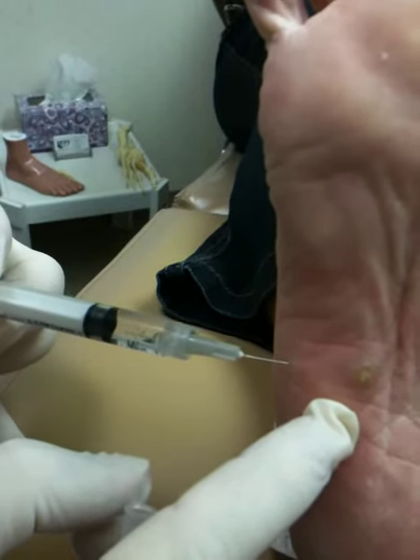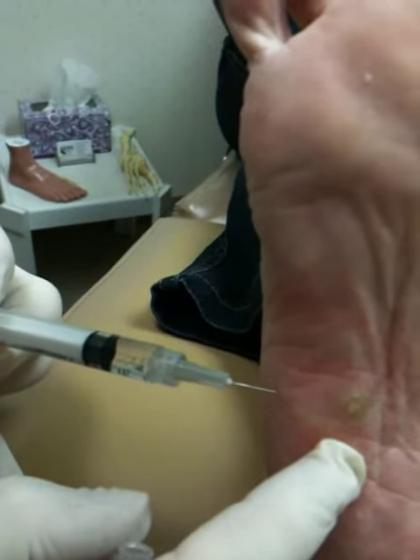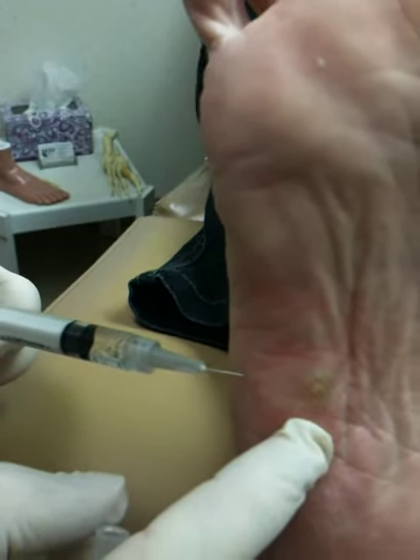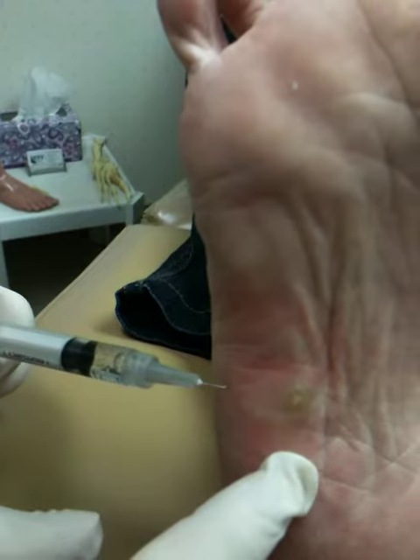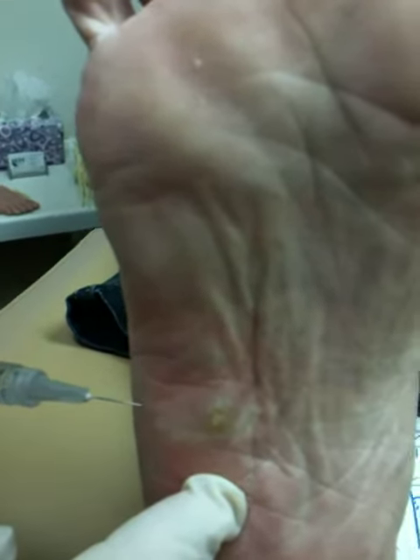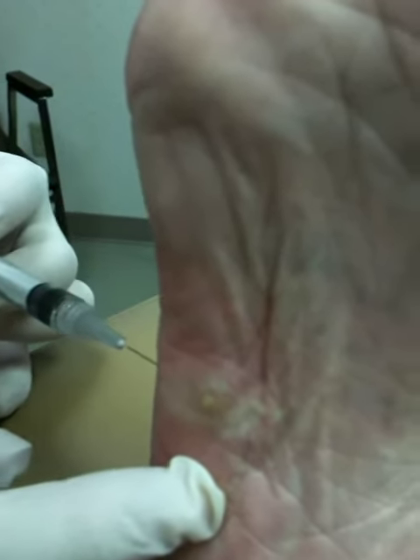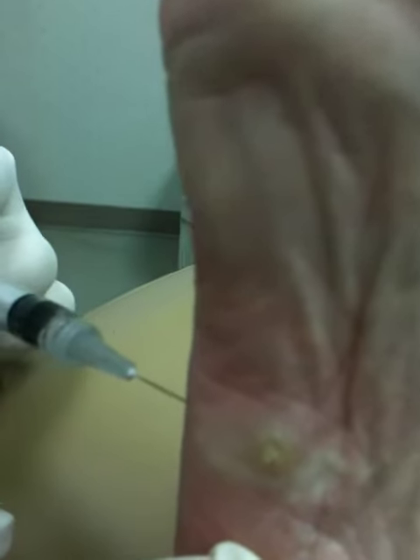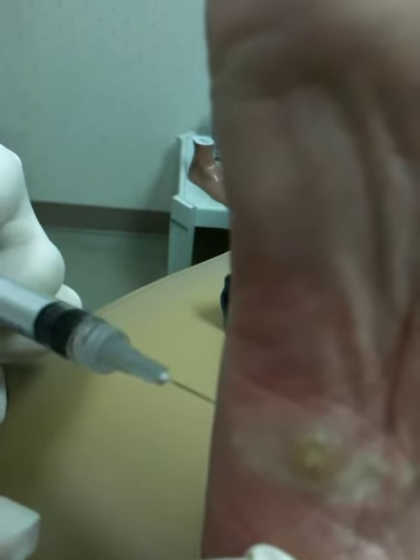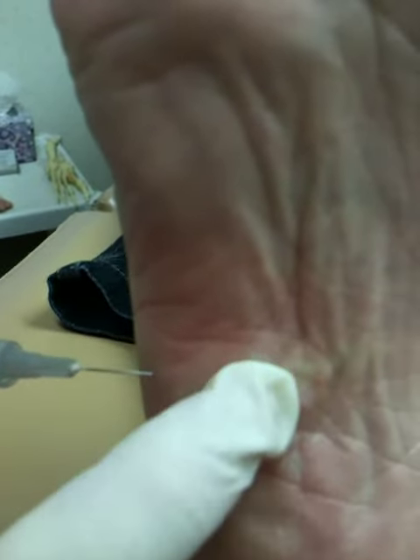We're over halfway with it. Now as we inject it, it's going to get white around it. We just want to make that area as white as possible. And when she scrubs your foot, this will probably be the only place you won't feel the brush on. Let's see — that's white. That's basically where we're going to take that spot.